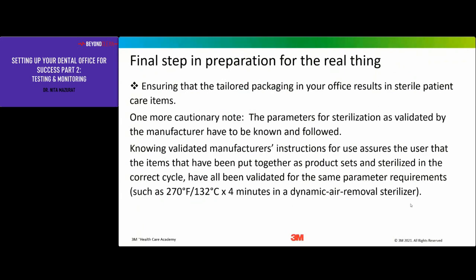When it's finished, we don't think a lot about the fact that the way that we've conformed or placed our instruments into our packages is really going to result in successful sterilization. So that's called qualification and performance qualification of your packaging.